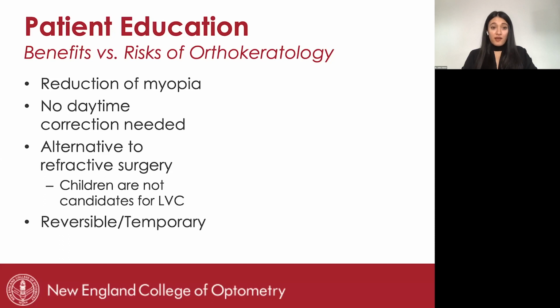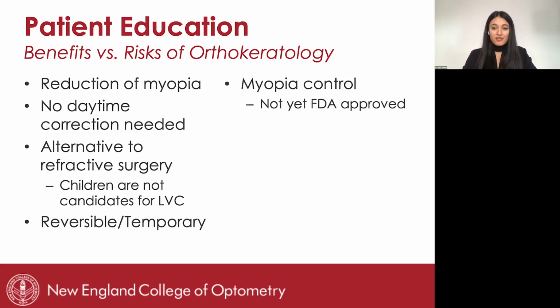We have to educate the patient that it is reversible and temporary. So if the patient is not wearing the lenses on a nightly basis, the reversibility kicks in, and they won't have good vision the next day. With that said, it's also a benefit of the treatment that it is temporary. So if the patient wants to stop Ortho-K wear for whatever reason, they just have to stop wearing the lenses, and over a course of 2 weeks to 1 month, their vision will come back to baseline. We discussed myopia control and that it's not FDA approved for the purpose of myopia control.